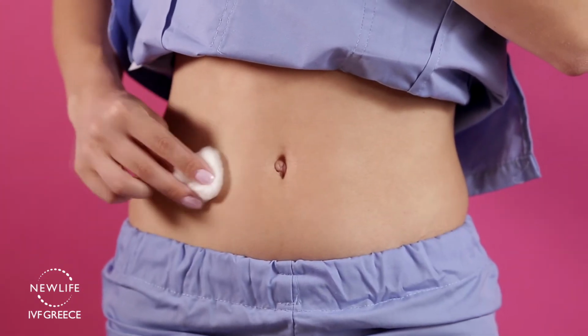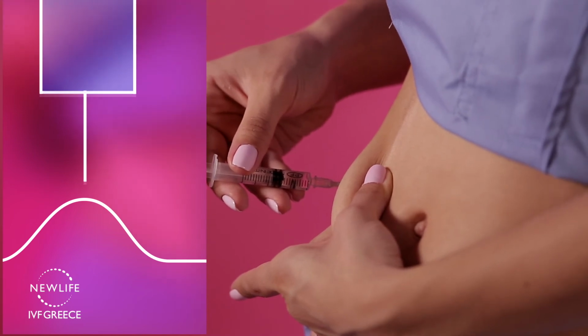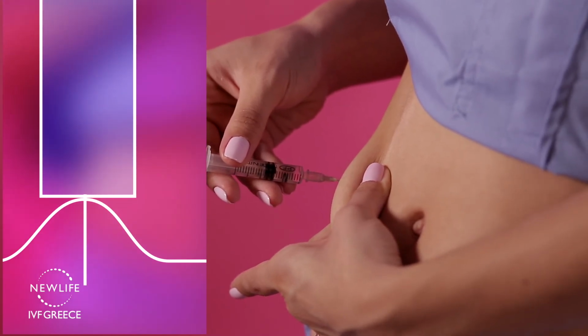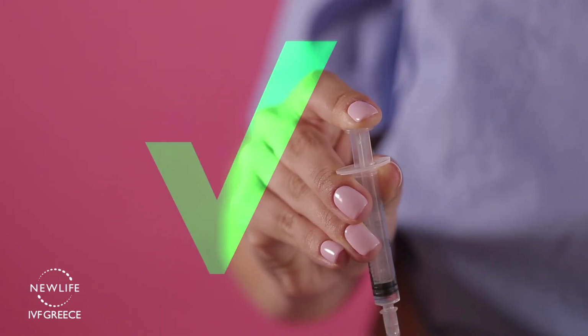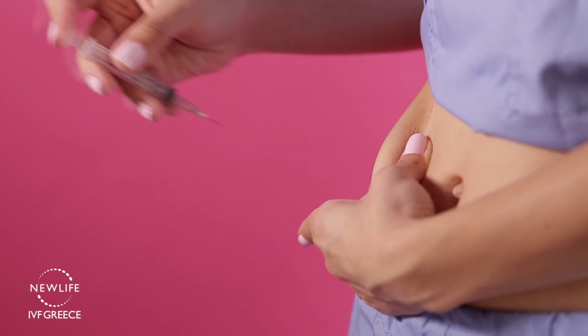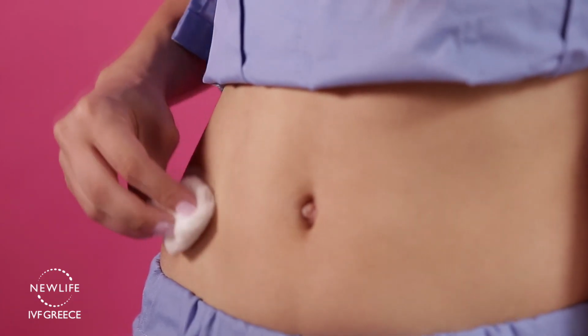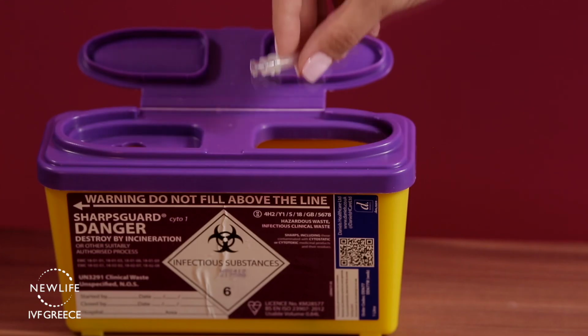With one hand, pinch your skin and insert the needle at a 90-degree angle. Push the plunger slowly and steadily, without stopping, as far as it will go. Next, let go of your skin and pull the needle out gently. Press down on the area for a couple of seconds with the swab while massaging it lightly.